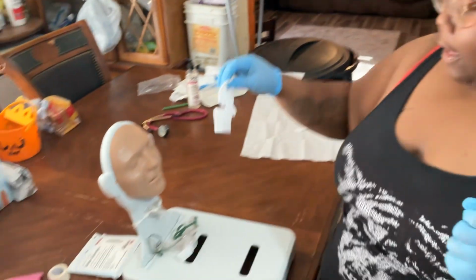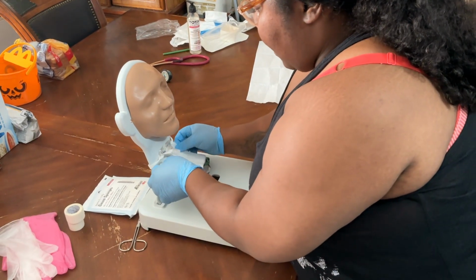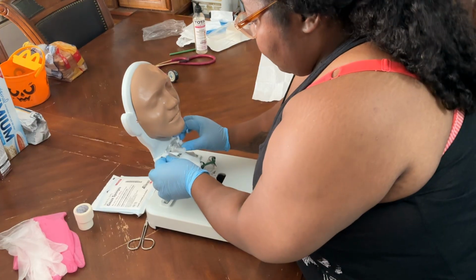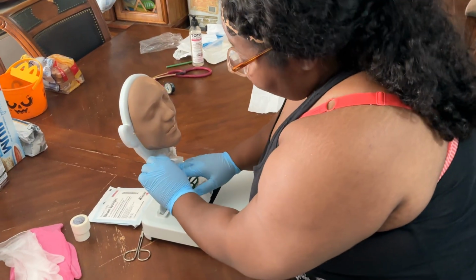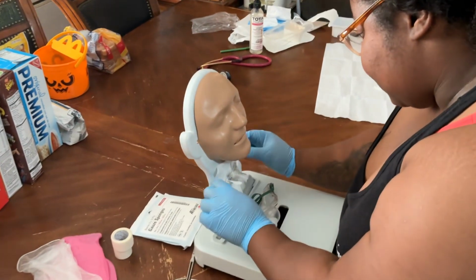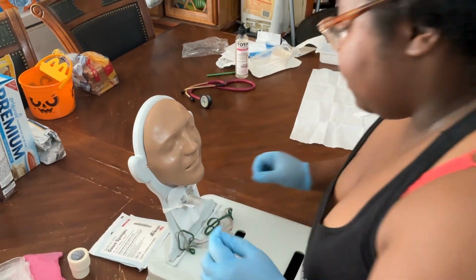So I can go ahead and put my patients. I can't do that with one hand. Let me verbalize that with this mannequin. I'm gonna go ahead and replace my dressing. I did dry it before I put that back on there. So it is dry. I'm careful not to leave it wet because I don't want any skin breakdown around that stoma. But I did dry it.